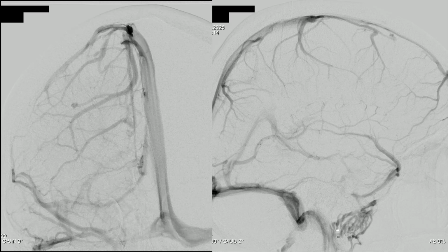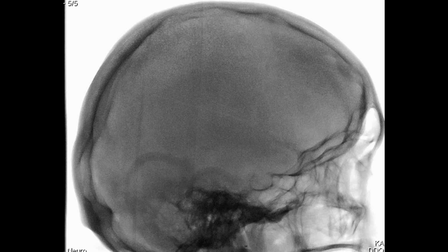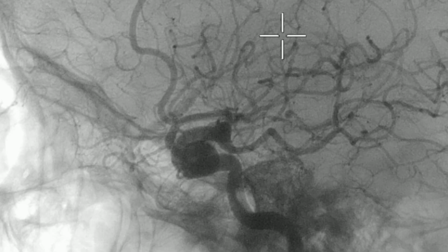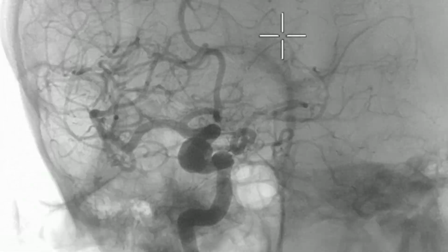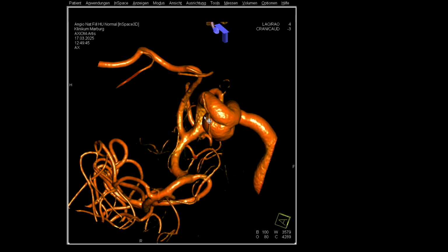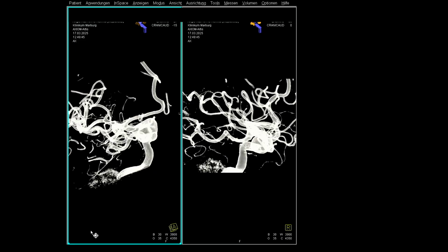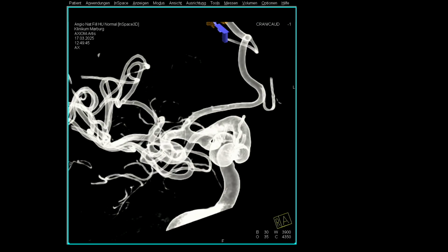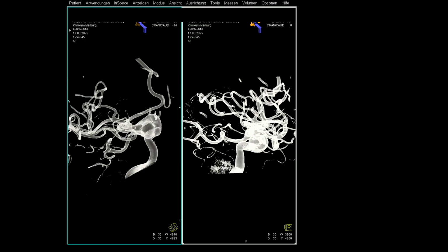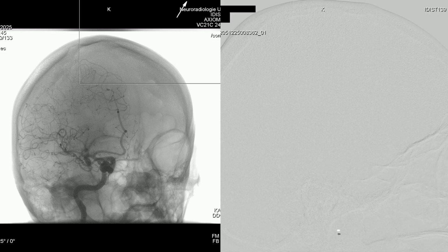Now we need the 3D angiogram to see the anatomy and plan our working projection. And here we see the aneurysm. Now we can adjust our working position. We take the translucent option to see the neck of the aneurysm better. Now we adjust our working position, which we will use for the coiling as well as for the implantation of the flow diverter. We take this projection and adjust our working position.